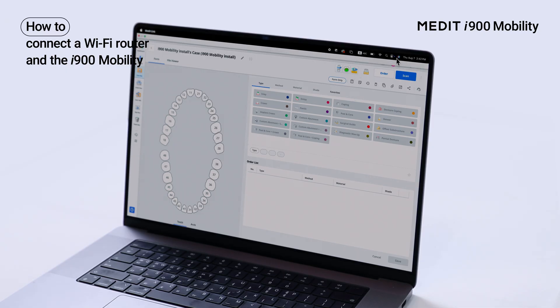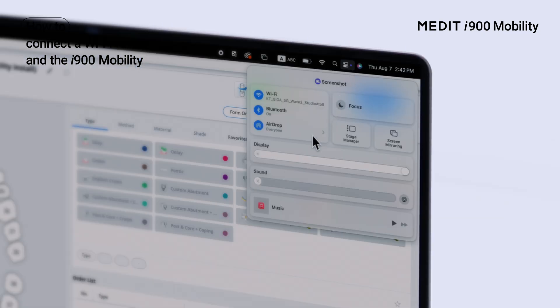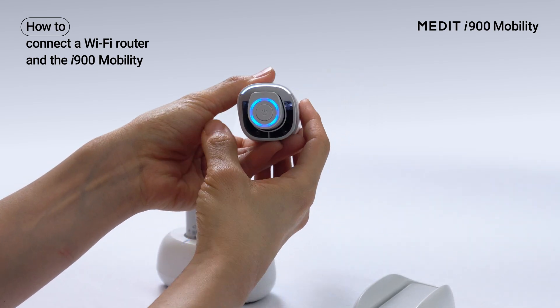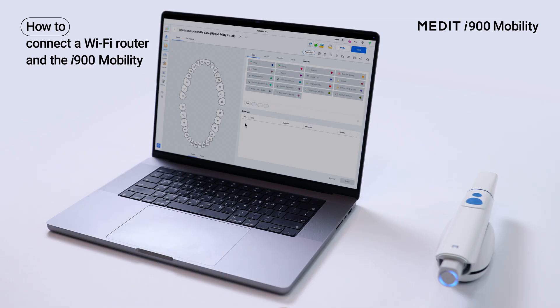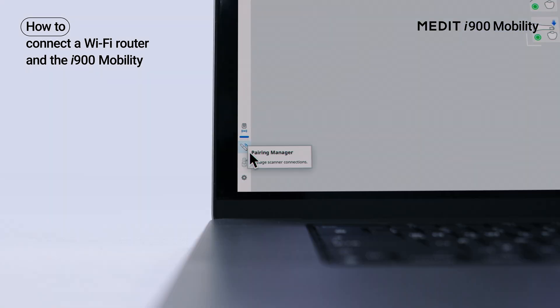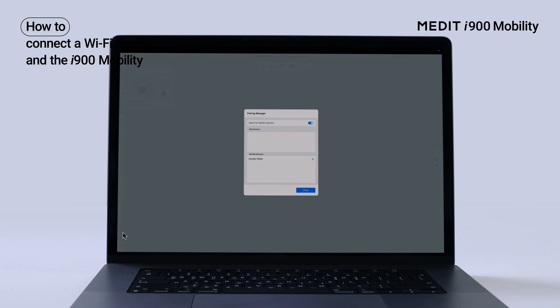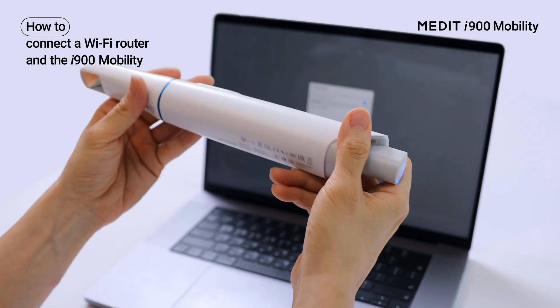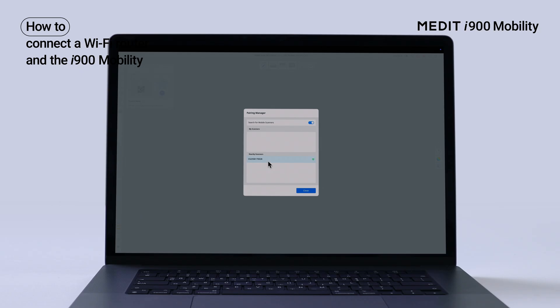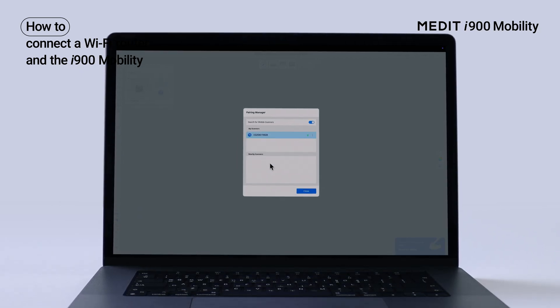When connecting through a router for the first time, enable Bluetooth on your PC. Turn on the scanner with the battery inserted and open Medit Scan for Clinics. From pairing manager, check the nearby scanner's serial number and pair it. You can find the serial number on the bottom of the scanner. Once paired, check your registered scanner under My Scanners.